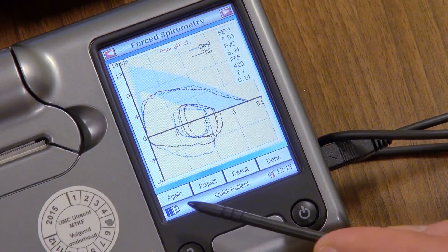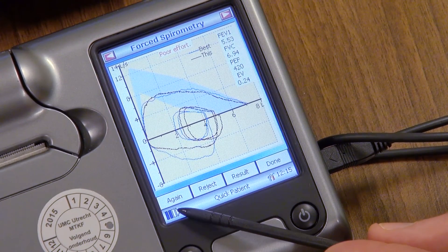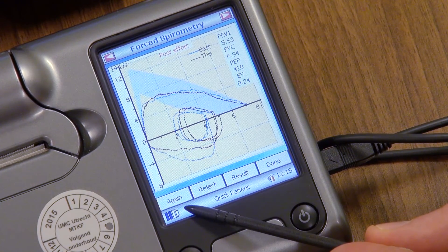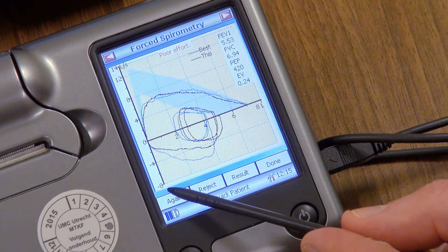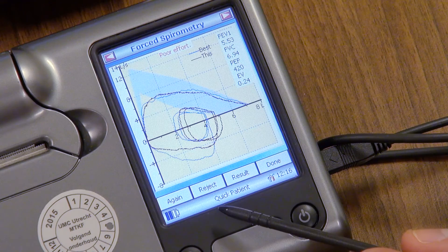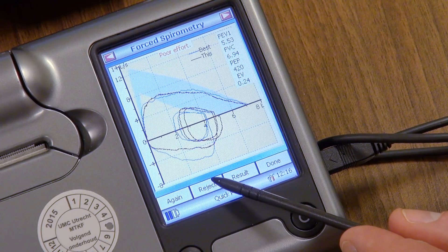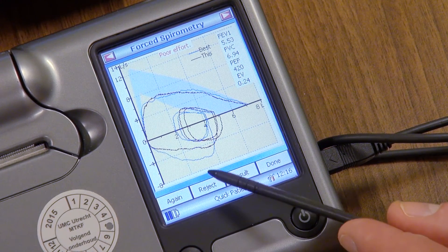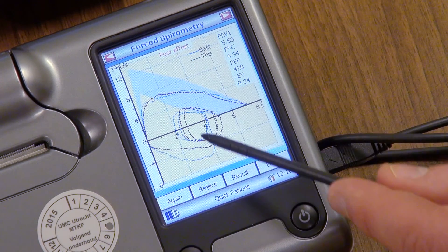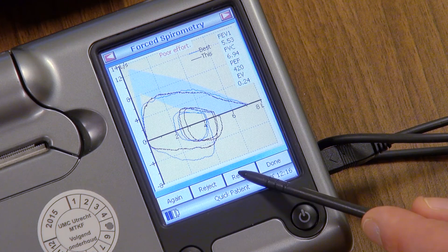Once the testing is complete, you will be able to select different options on the device. You can press again if you wish to perform another test. You can press reject if the device indicates that the blow was insufficient. You can press results to view the results of the test.